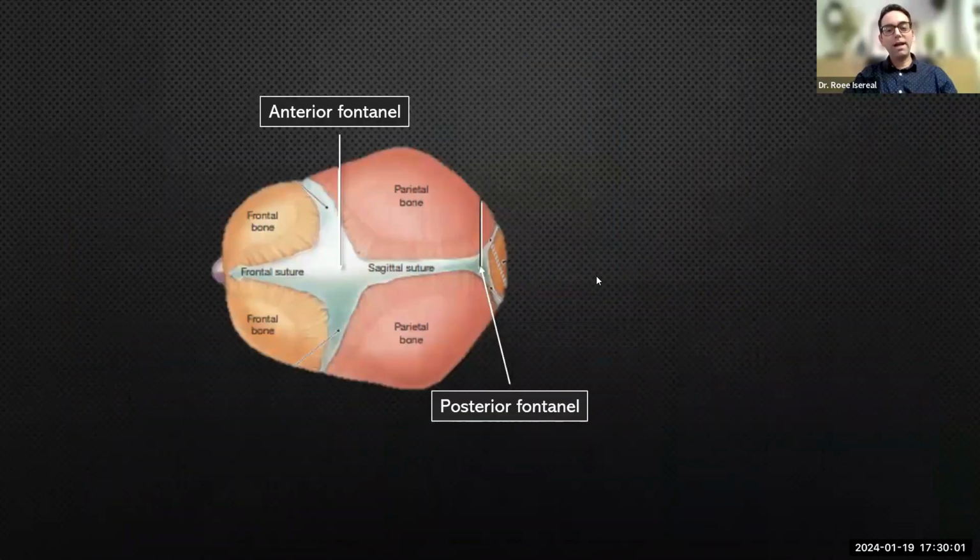Now, I would like to highlight a few technical issues for the ultrasound because it requires high quality ultrasound. So let me give you just some tips and tricks. First of all, remember that our acoustic windows for a good neurosonography include both the anterior and the posterior fontanelle. However, when we are talking about the midbrain, hindbrain anatomy, or the anatomy which is located inside the posterior fossa, we always must use the posterior fontanelle and sometimes the mastoid fontanelle, but the posterior ones. We cannot see the posterior fossa very nicely going through the anterior fontanelle.